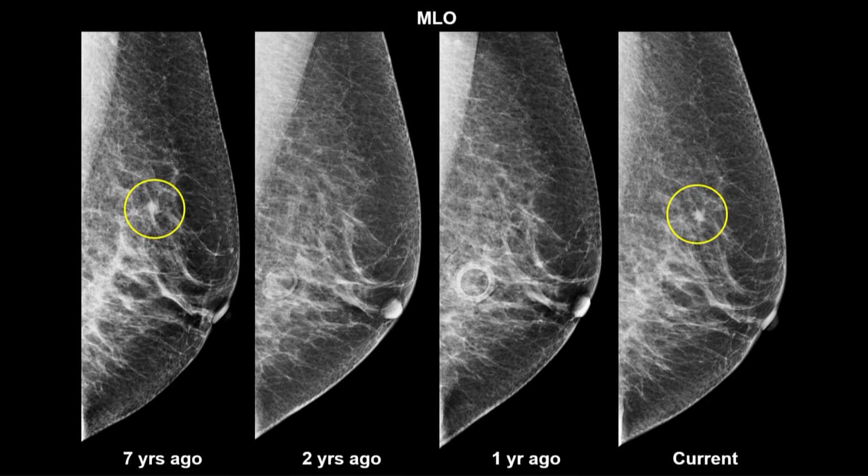What does this mean? This means it's a summation artifact. See it, don't see it, don't see it, don't see it, don't see it, see it. You only see it when things overlap exactly right. If we were doing this workshop in a very small room where there are only a few of us and I could stand in front of the projector, I would hold up 2 fingers and align them and show you that as you move the 2 fingers, only when they're exactly superimposed do you see a single darker shadow.